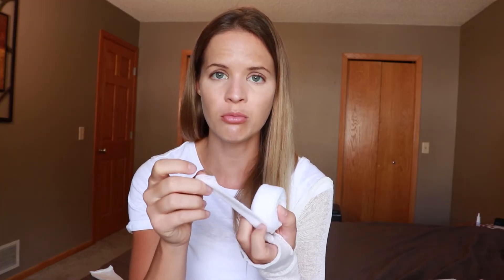After you get your stockinette on, the next thing we're going to do is wrap the fingers, using that 1-inch double-folded roll. It doesn't really matter what finger you start with — find what fits best for you. When you put it on, think about putting it on like a snail. The back of the snail faces up and the bottom goes against the skin — doing it upside down makes it a lot more challenging. Place the bottom of the snail on your skin like this and it's easier to roll.